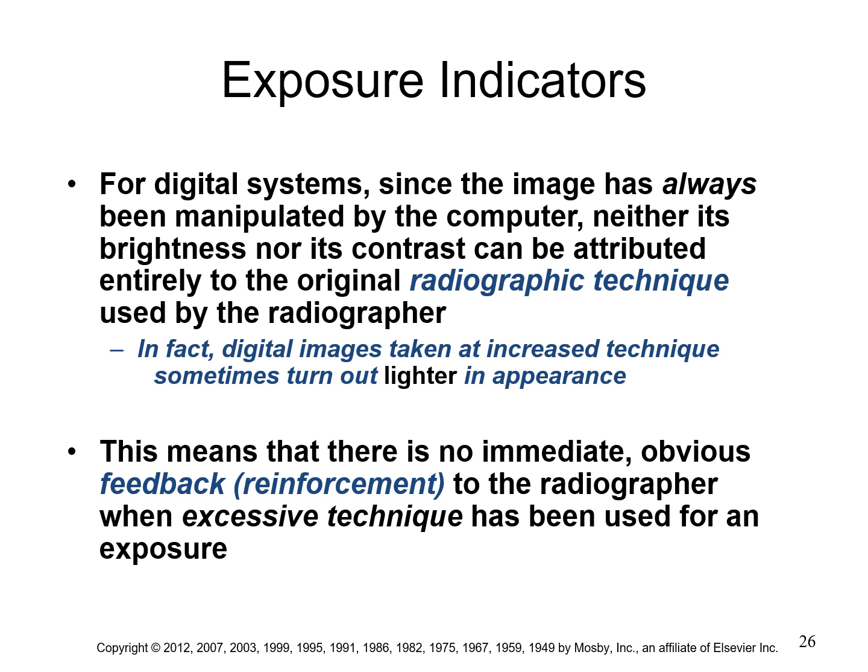Now, the problem with that is techs can go around overexposing up to 6 times more radiation than they actually need, and there's no visual indicator. The image doesn't get darker anymore when you overexpose. Okay? In fact, for some software, the image actually gets lighter. So it's really, really tricky. Unless you're looking up your exposure indicators and keeping track of them, you really don't know as a modern radiographer if you're overexposing your patients or not.